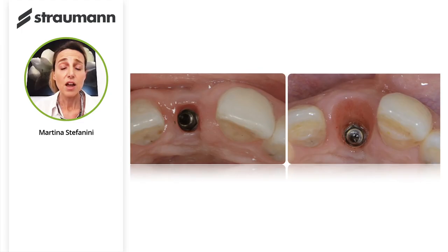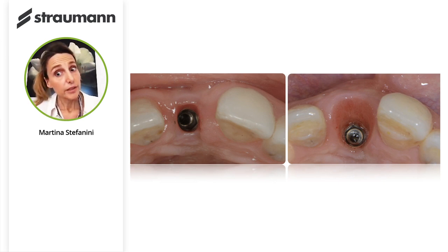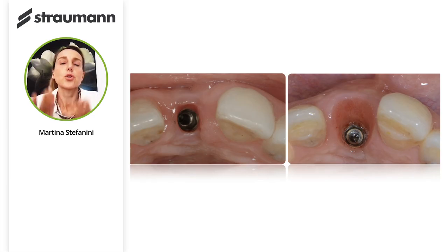So you can see in an occlusal picture the thickness of the transmucosal area, which is more than 2 millimeters and which is longer because we should compensate for the malposition of the implant, and we need to obtain the mucosal margin at the same level as the homologous central incisor.